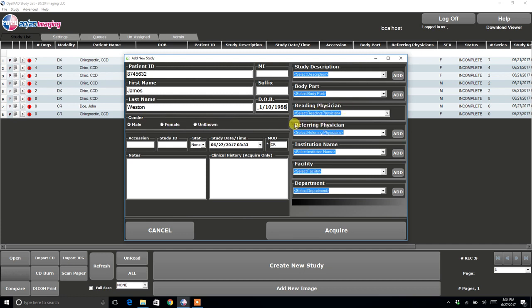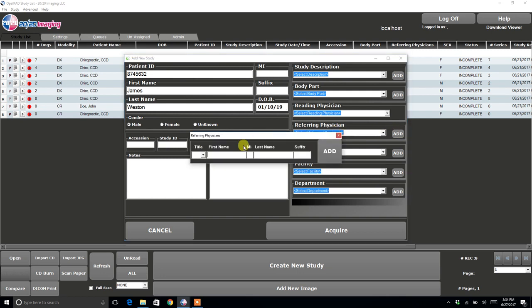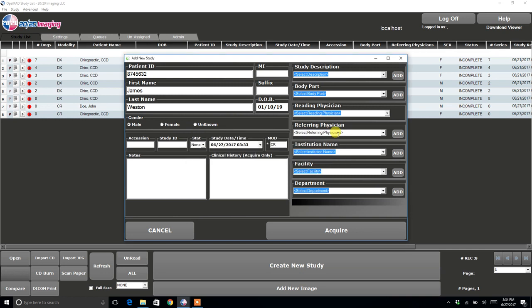And then if this is your first time using the software, you would want to enter in your name under the Referring Physician. So you just click Add, select your title, enter your first name, last name, and then just click Add. That will add that to the list.